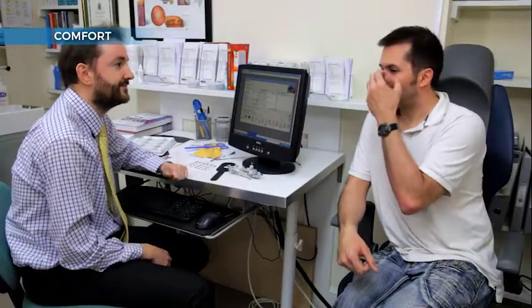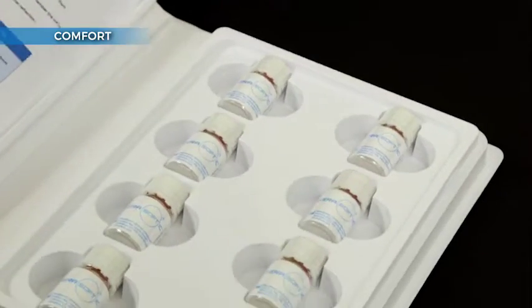During the assessment of the lens, the patient should be asked about the lens comfort. If a patient has never worn lenses before, they may take the normal settling time to become comfortable. If a patient has experienced discomfort with previous lens types, it is important to emphasise that these soft lenses should be very comfortable.